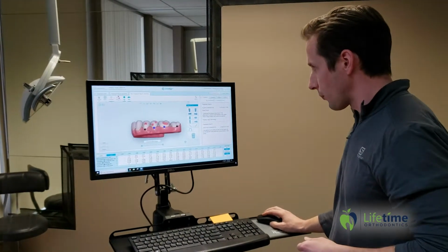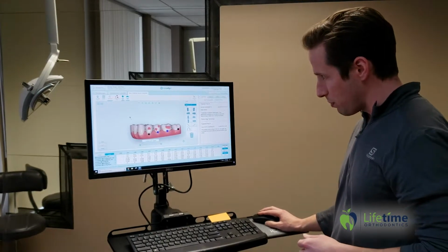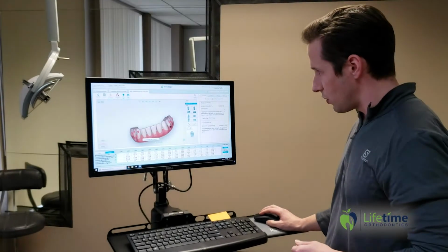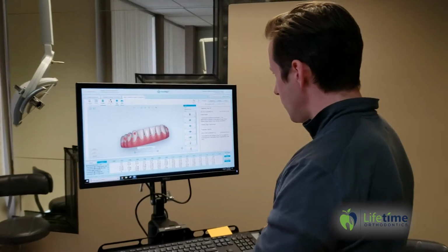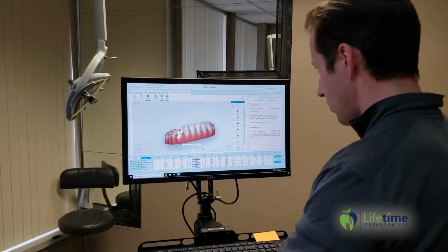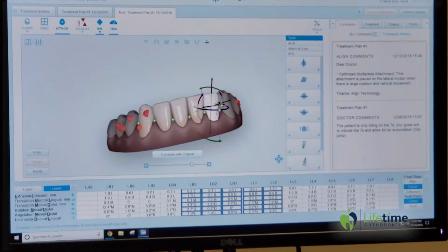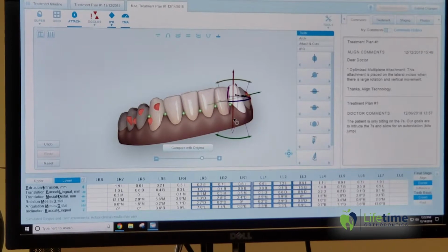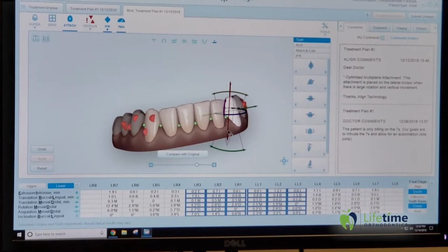On the bottom here, I kind of have a deep bite. These incisors seem to come up. So what I'm going to do here is I'm going to intrude these incisors a little bit as well. And so we can do this by moving all the teeth. I can click on this tooth and we can hold all these teeth, and I can, as a group, intrude them, meaning push them down, okay? So what we're going to do is just kind of push these down. See how the whole set goes down?